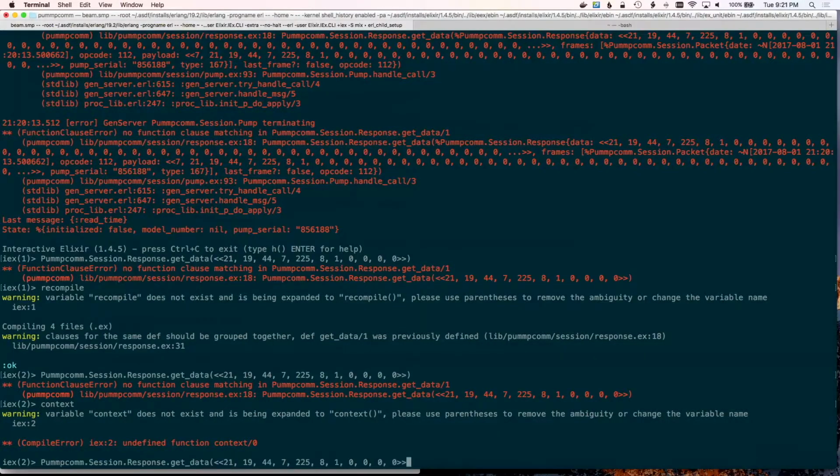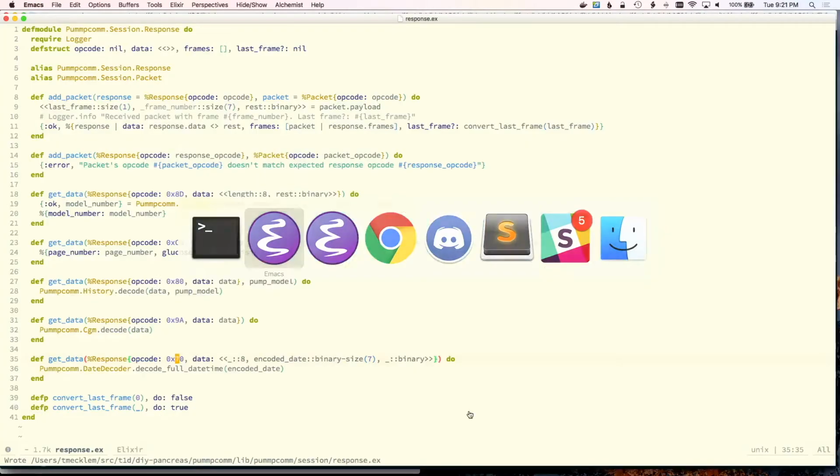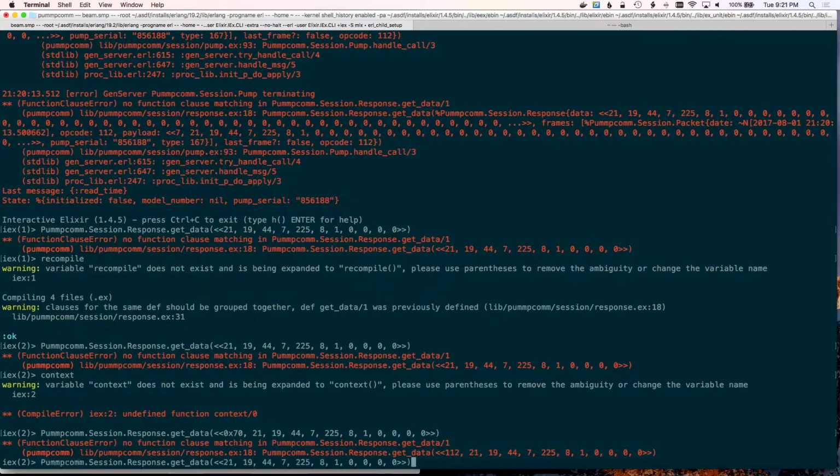I think what gets passed in here is actually the command opcode as well, but it still doesn't seem to be working. Oh, it wants a full response object. Okay. Try it again.